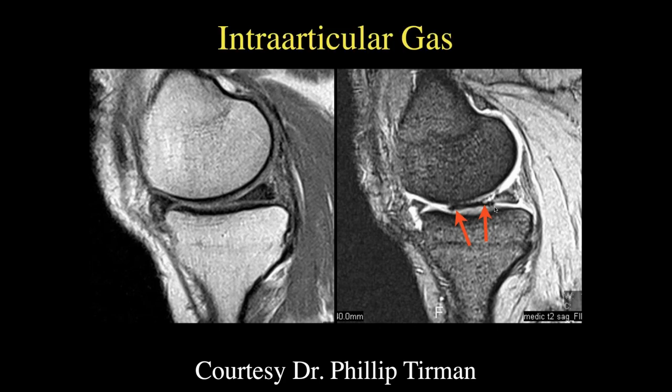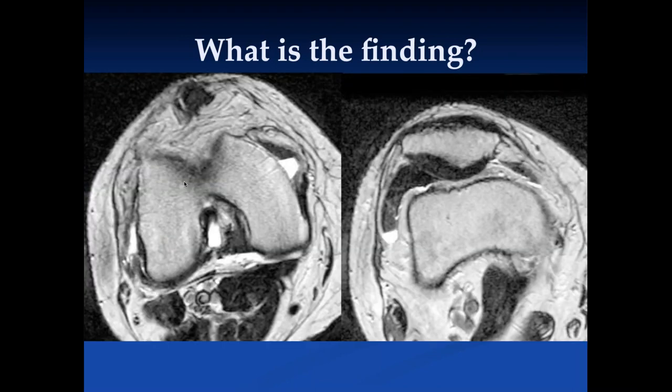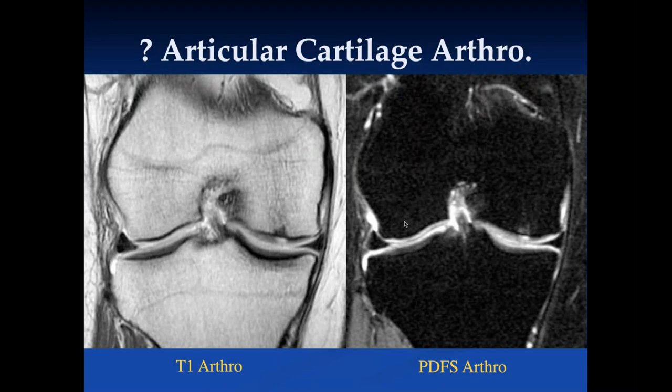Here we can see low signal intensity in all images — this was intra-articular gas, which you can get, typically nitrogen, when you distract the knee while positioning the patient. There's also a focal area of low signal intensity adjacent to the patella, and when we do the axial images we see a fluid level — this was actually MR imaging done after hyaluronic acid was injected into the joint space. There are other things that can change the contrast of fluid in the joint space.